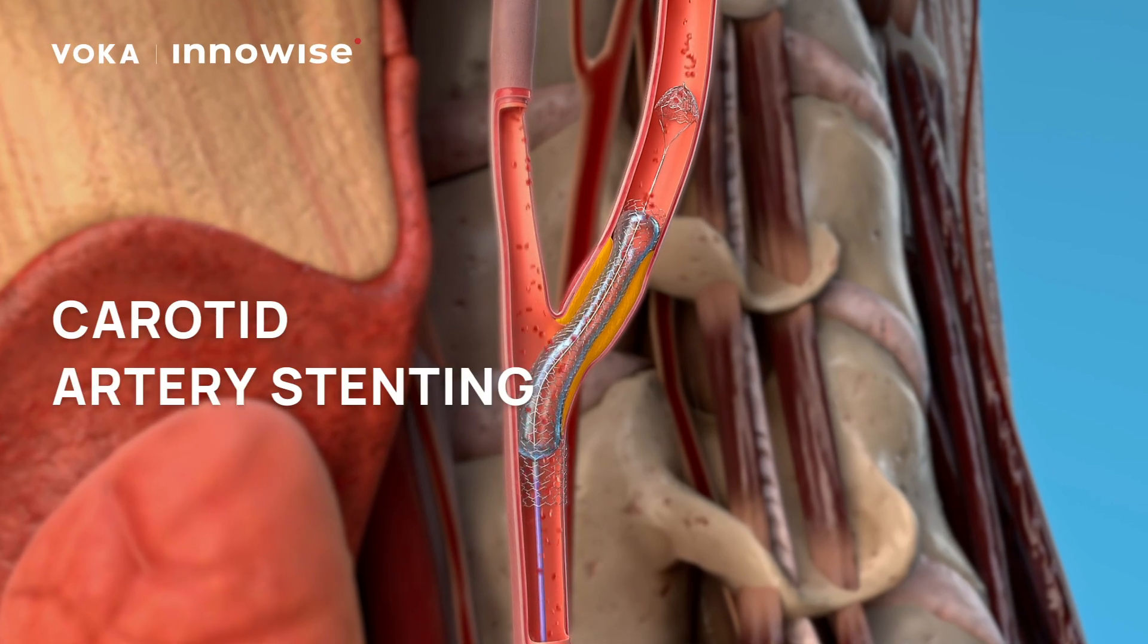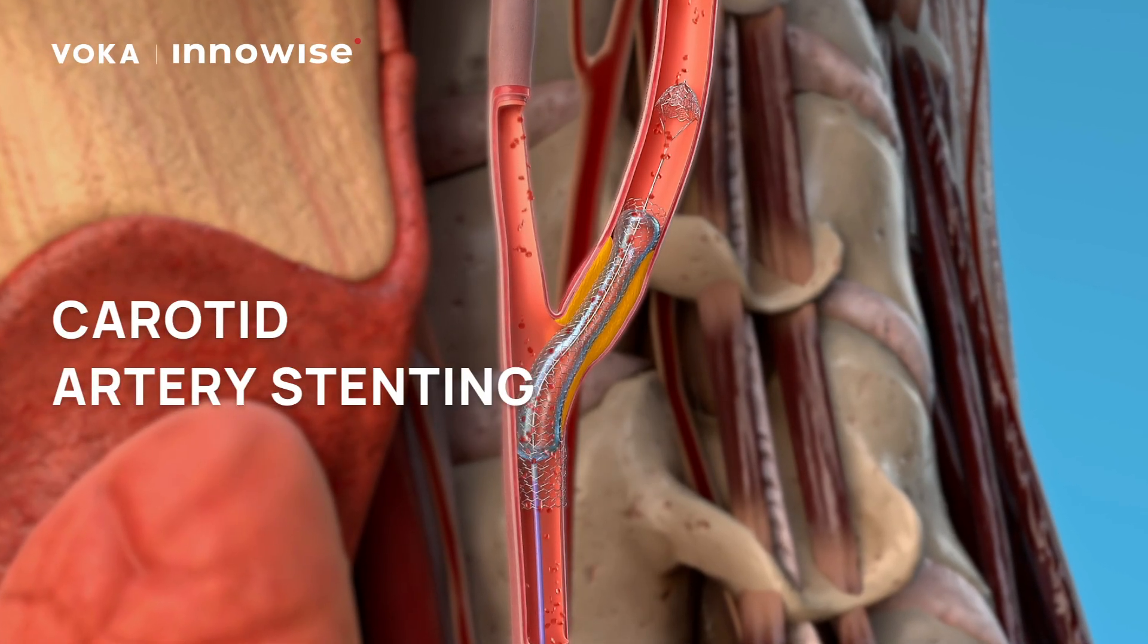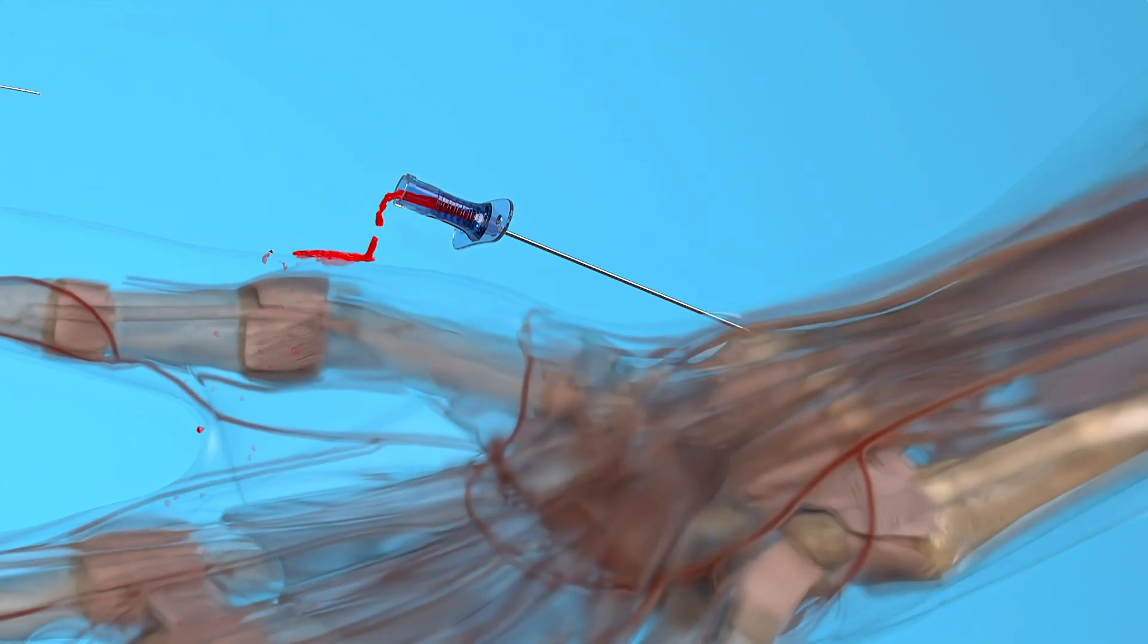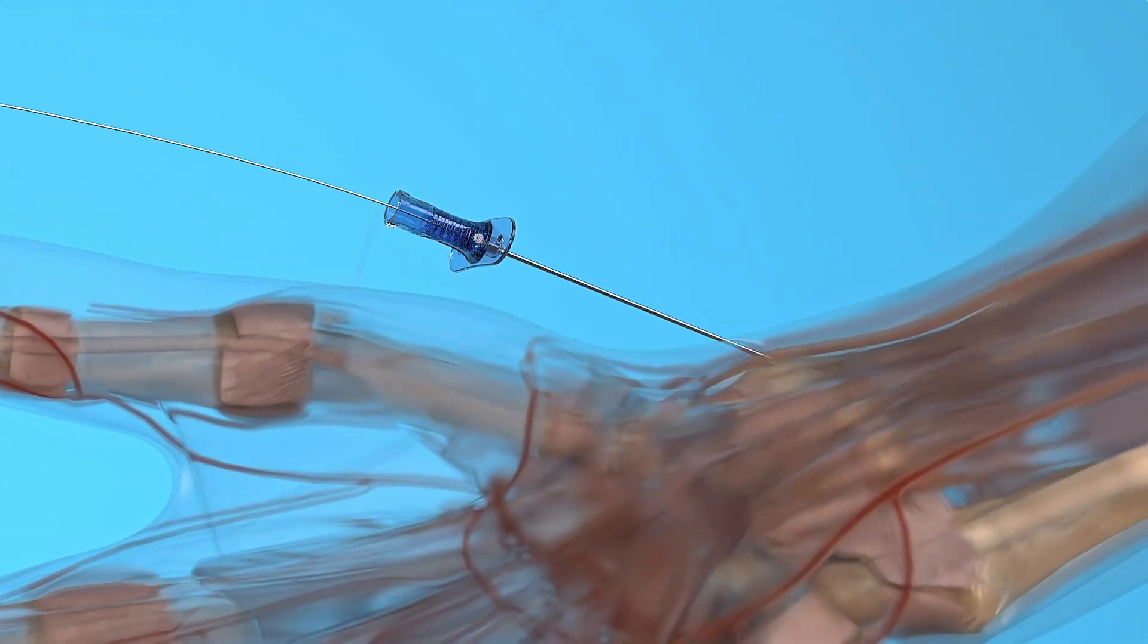An effective and minimally invasive method of treating atherosclerosis is the stenting of the internal carotid artery. The procedure can be performed through the radial or femoral artery.